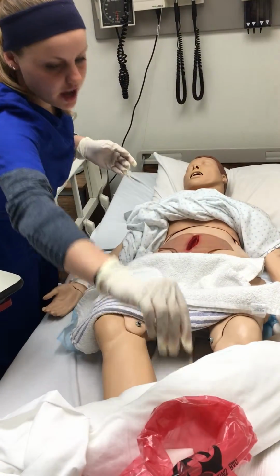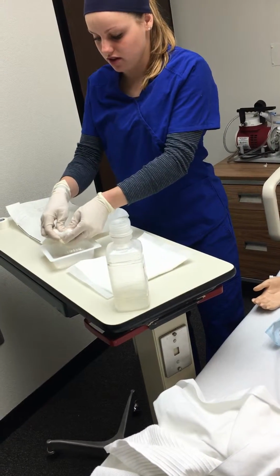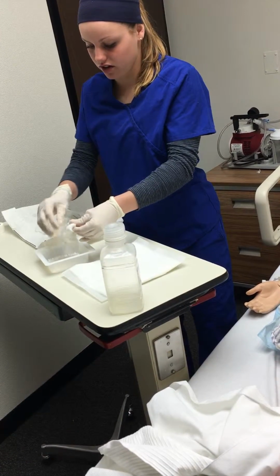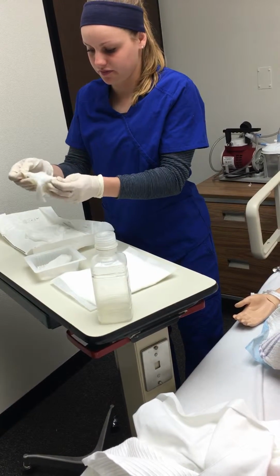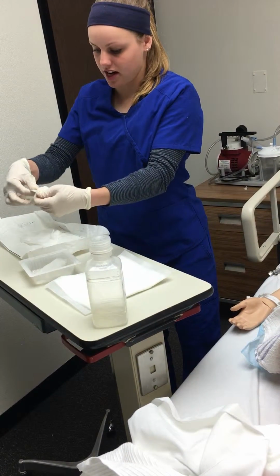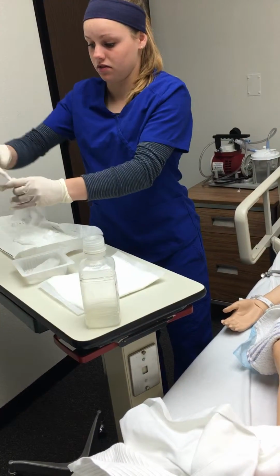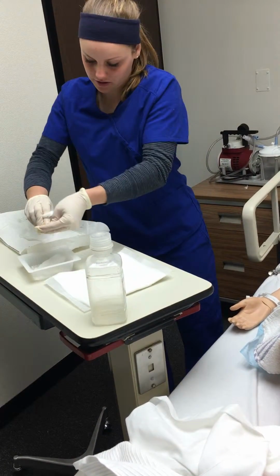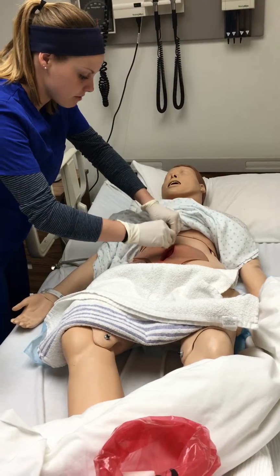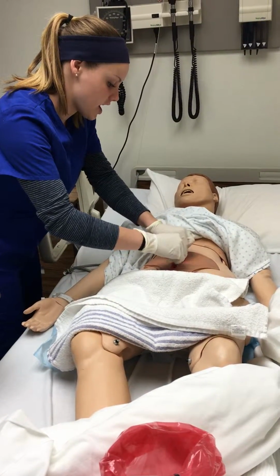Okay. This is wet to dry, so since I got my saline here, we're going to pack this wound with the saline covered dressing. I'm going to coil it around my finger to get it out. And we're going to pack that into Annie's wound. Scrunch it up, squeeze it out. Okay. I'm not going to touch the outside part of her skin because that is contaminated. So we're just going to pack this in here.